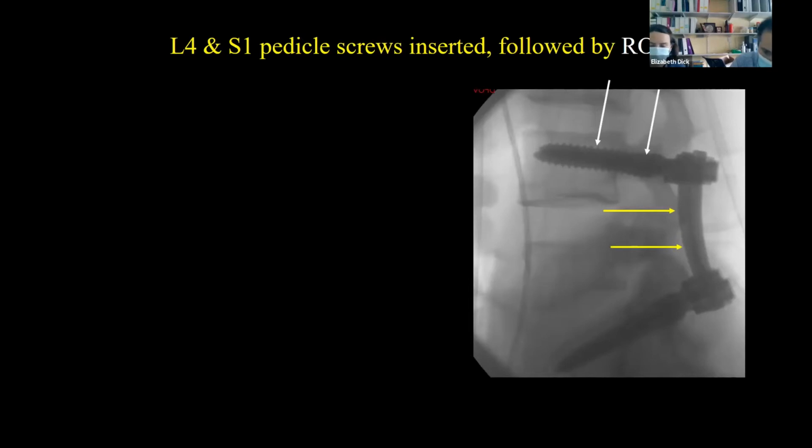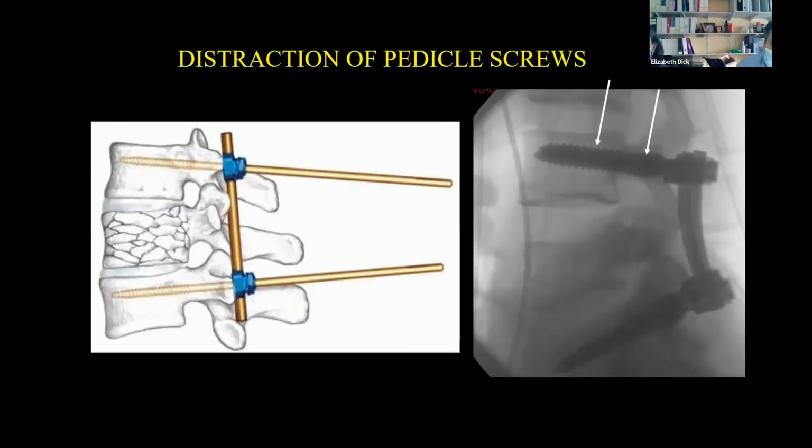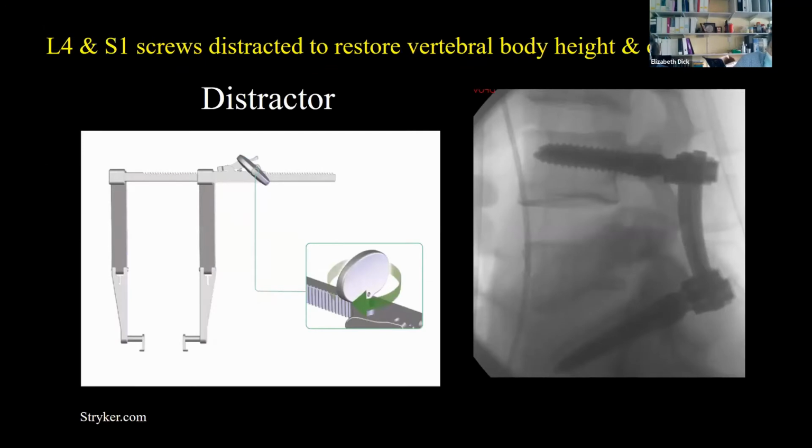And distraction basically means you pull on it on either end using sometimes instruments. This is a particular set. It's not related necessarily to the picture on the right, but this is an AO reduction instrumentation. You see there, you've got a straight rod, but that allows distraction of the ligamentous part, and at the same time, therefore, it distracts the fracture in the middle and realigns it. Hopefully, if there's been a significant loss of vertebral body height, this can help restore that just by distraction.